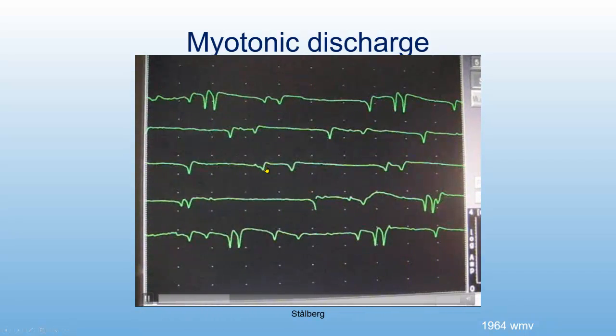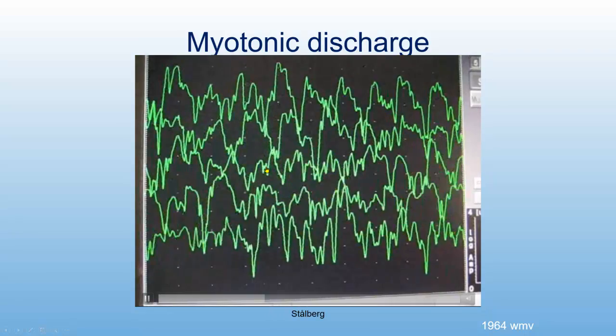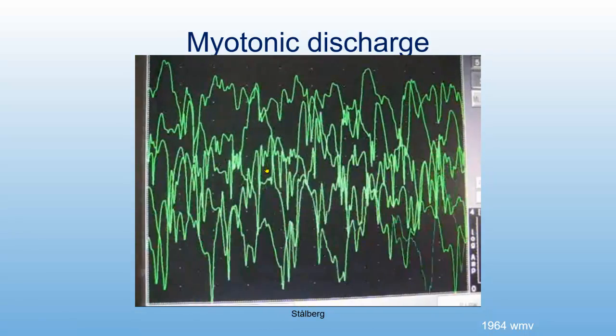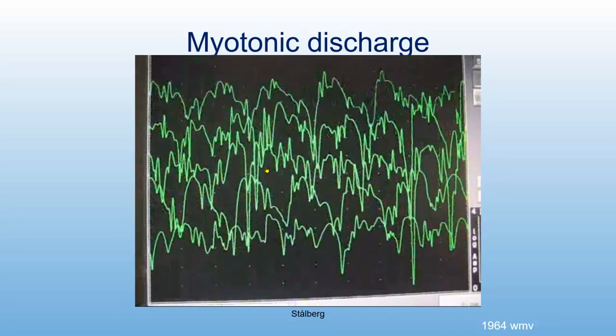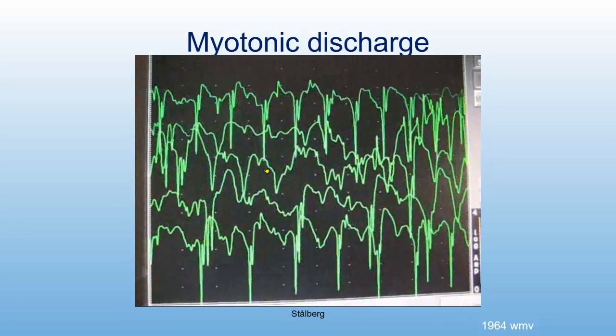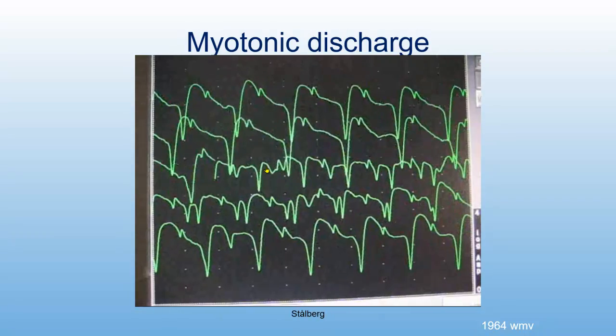and we have these positive waves. I move the needle. You heard something there, and that is a myotonic run.